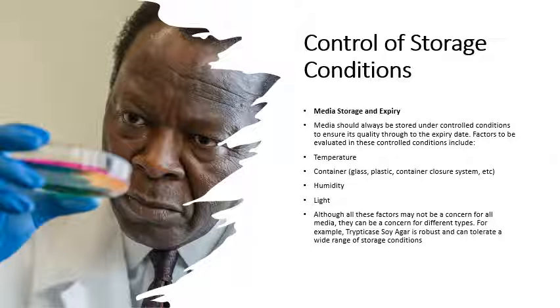So a careful look, just the way the scientist in this slide is giving, must be ensured to see if the media is still in good condition. However, such a careful look is not when you are holding the petri dish, it is before the media is prepared.